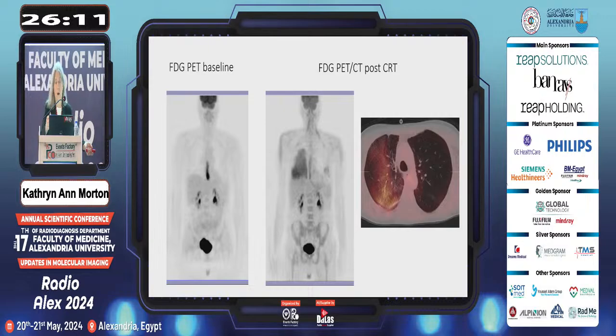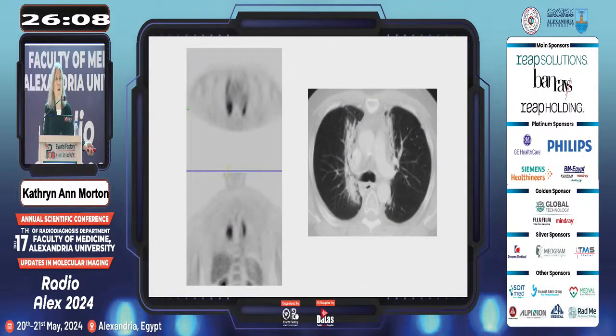Generally, this will go away by about 3 months, but the activity does not necessarily go away when you have cicatricial atelectasis resulting from radiation, because there are multiple dilated airways, bronchiectasis and bronchiolectasis within this, and those are chronically inflamed. And so this appearance is typical of radiation fibrosis, cicatricial atelectasis with chronic inflammation, and it can persist indefinitely.